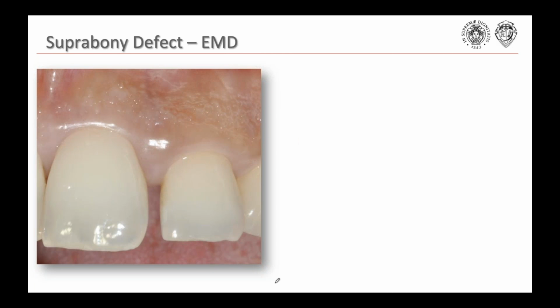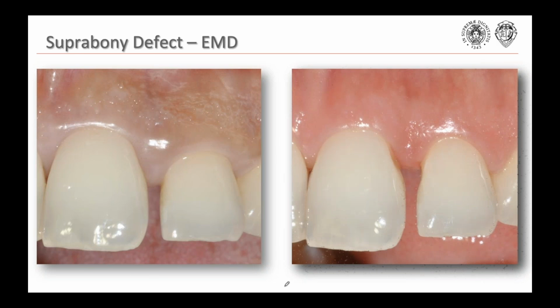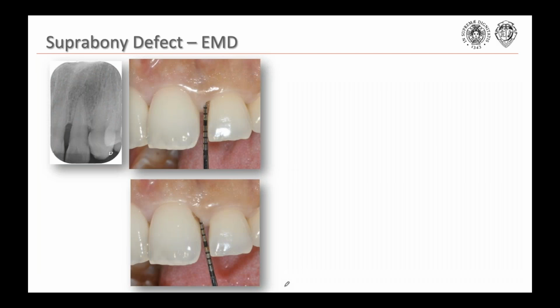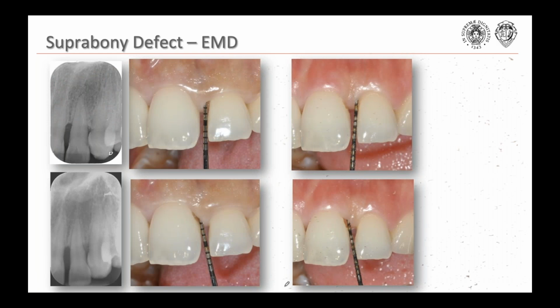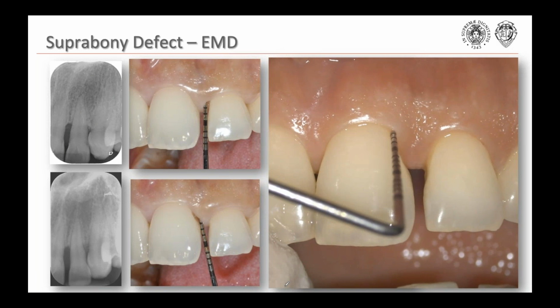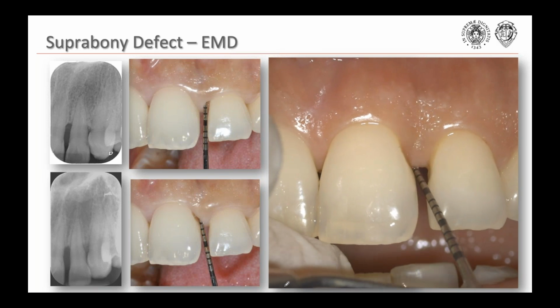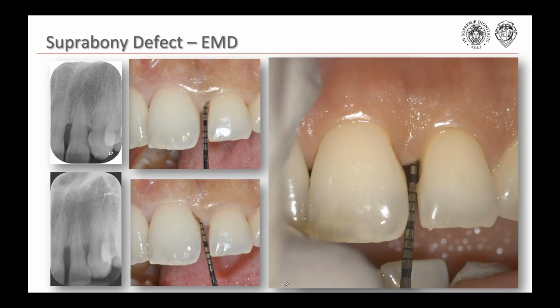Look now, the healing, I think, is peculiar. This is 6 months after the surgery, then 1 year, then 2 years. And you see the creeping attachment, the papilla that is reforming. But despite there is an increase of soft tissue, you can see in 1 year the pockets are closed, and this is actually just a few weeks ago, which should be now approximately 3 years and a half with the area closed.